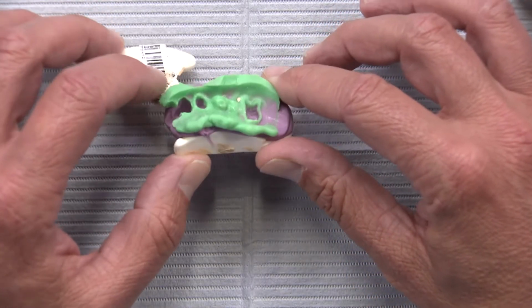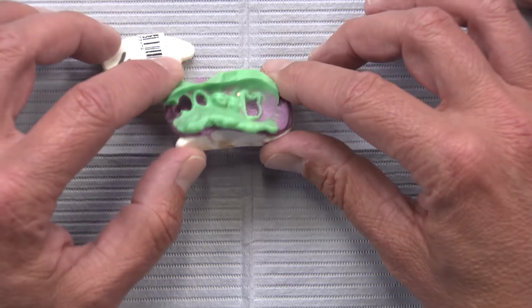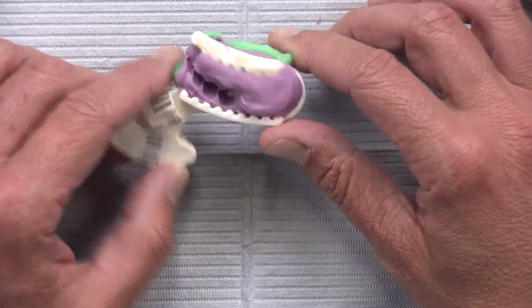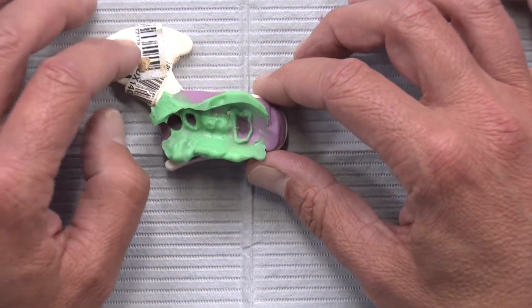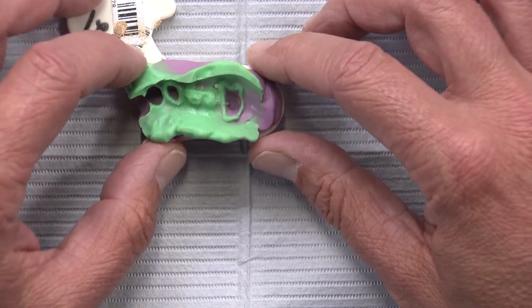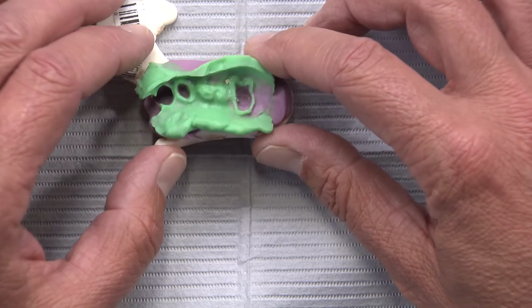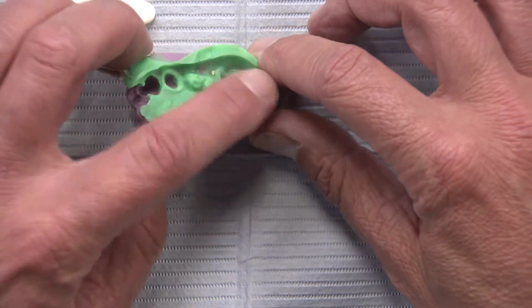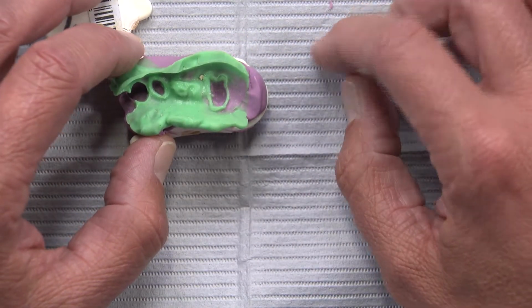One of the technical advisors had a question brought up on my desk. It's the 4-unit bridge in the double arch tray, in the triple tray, and that's really kind of a violation of what these trays were designed for. We've gone over it a lot of times before. They're great for single crown preps or two single crown preps that are adjacent to each other, but they're really contraindicated for 4-unit bridges, and especially when it contains the most distal tooth in the arch.